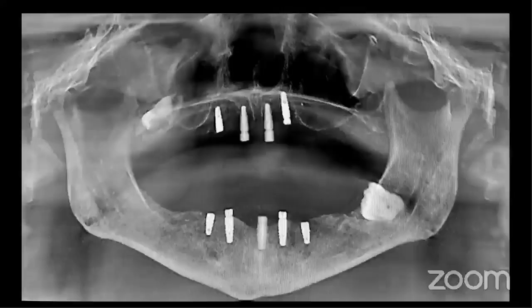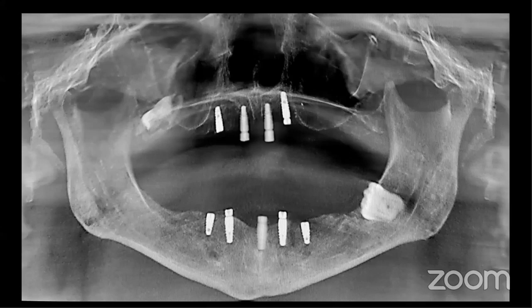So now that we've covered a brief description of the history and the anatomy and the indications and contraindications for these types of implants, I'm going to show you one last case, because we have just a limited amount of time to go over all of this. In this particular case, this patient had actually come to see us originally in our office, and we presented him with a treatment plan, and then he disappeared for a couple of years. What we ended up finding was that he had gone to another office in town, a low-cost denture center type of office. And they ended up removing his teeth and placing implants. Over about an 18-month period of time, the number of implants they placed kept changing, because they placed some implants, they would fail, they removed them, and they placed other implants.